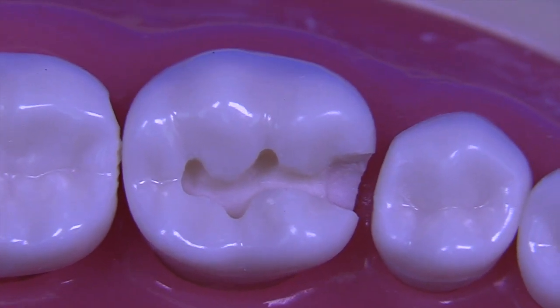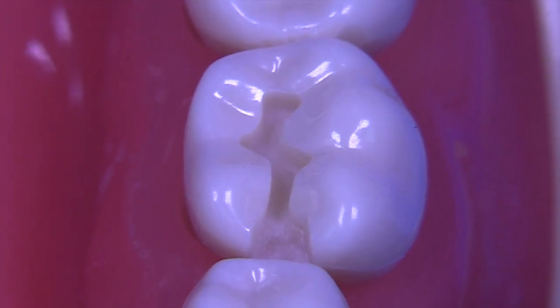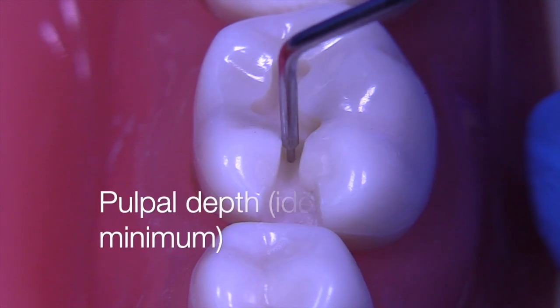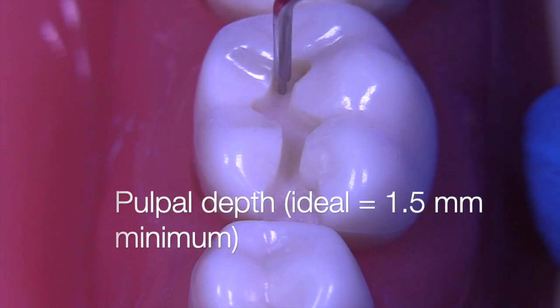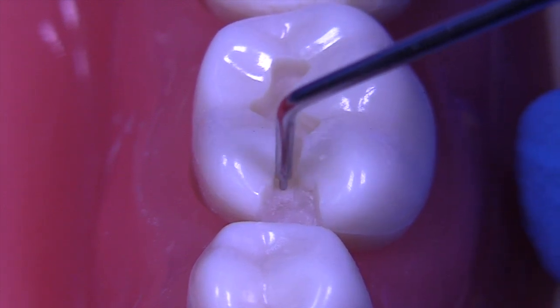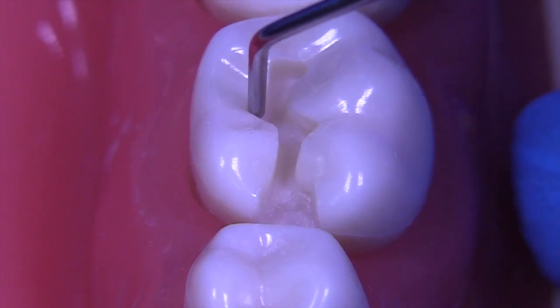Now let's turn our attention to depth. So when we talk about depth, we're looking at two different things, really. We're looking at pulpal depth, which is the distance from the cavosurface down to the pulpal wall, and we want to make sure that it's at least 1.5 in all areas for amalgam. This is an amalgam, so we want this to be 1.5 in all areas.